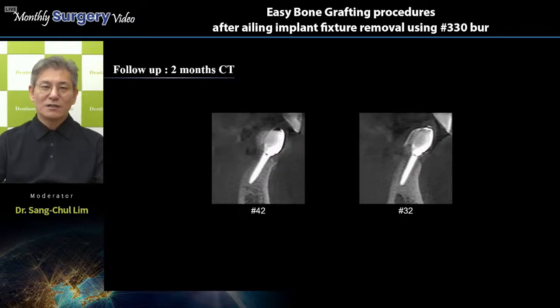In conclusion, the previous surgical procedure gave us one lesson, right? Even though the ridge area is small and narrow, a simpler installation with Bright TL using collagen graft and collagen bone is an easier way to restore this edentulous, narrowed lower anterior ridge.